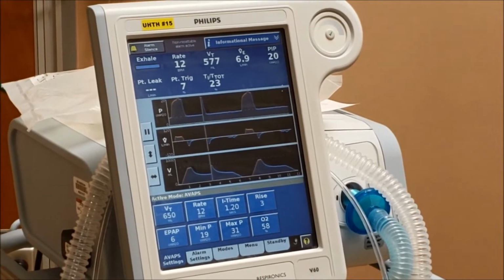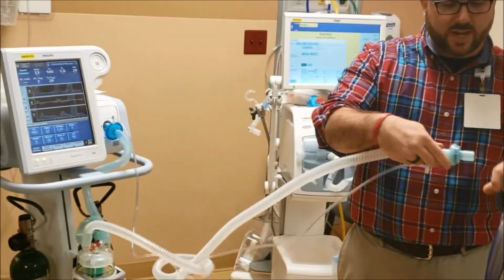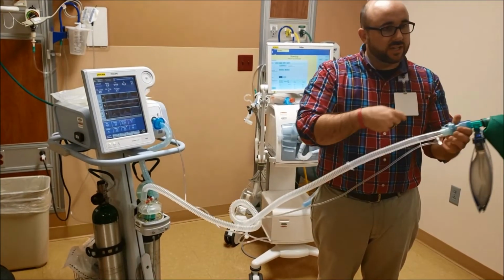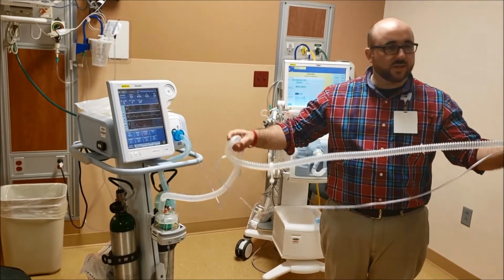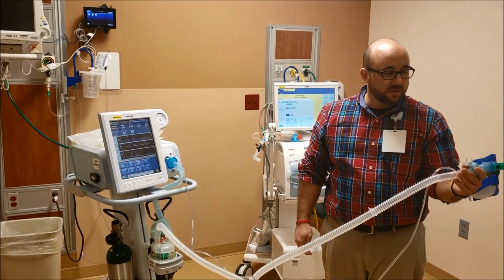AVAPS is really cool. It would hook straight up to the endotracheal tube through this. Looks just like the hookup you have now. The only difference is there's a constant amount of air blowing out of here, and that's just circulation because you notice this is single limb and there's no internal circuit. So this constant circulating of air is how they exhale. So that would hook up.